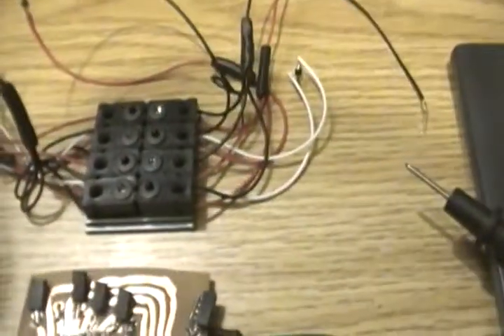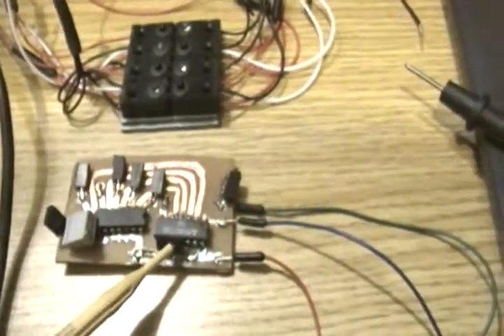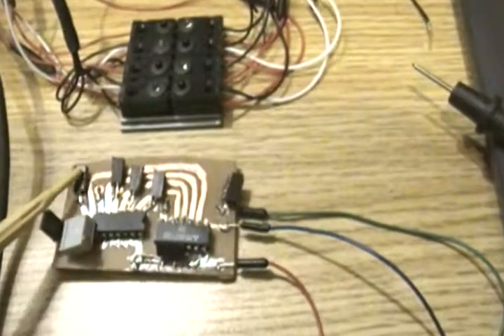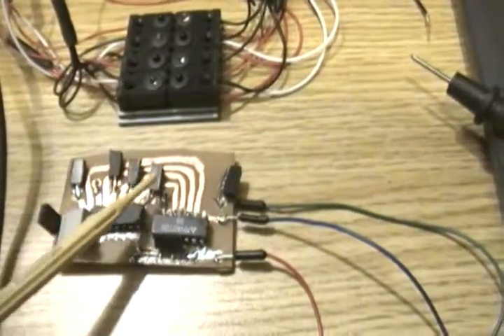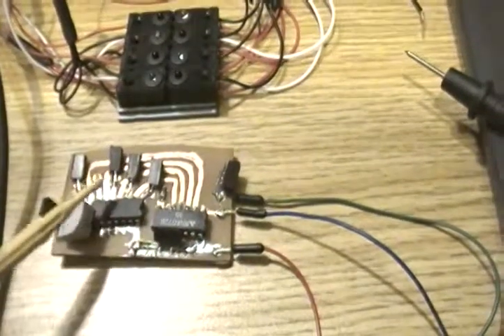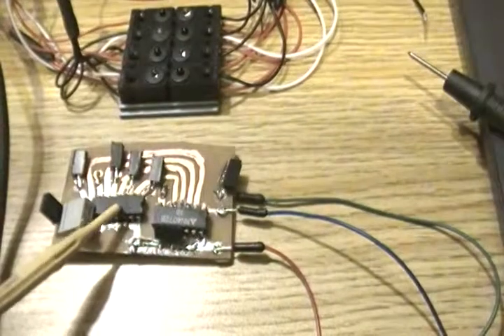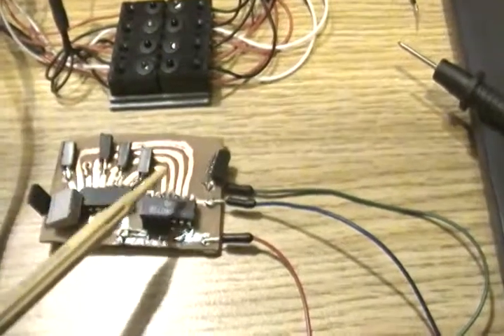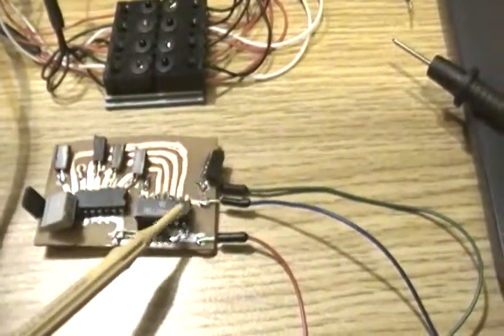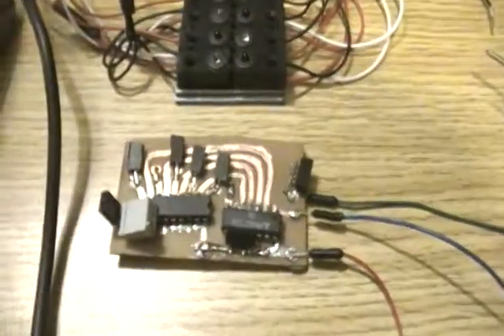And the way you plug this in here, LEDs go here, detectors go there, and the white wires, which are the data from each detector, they go into one of these things. It doesn't matter which order. Signal goes in, goes through a trigger, goes to a logical OR gate, and then it goes all one wire out to the interrupt of the Arduino.